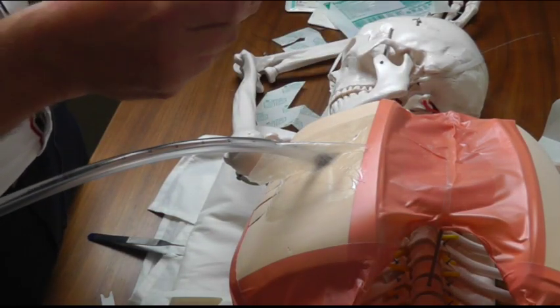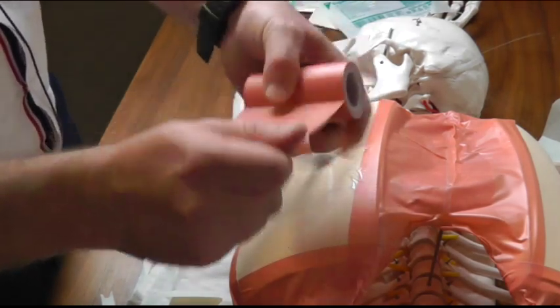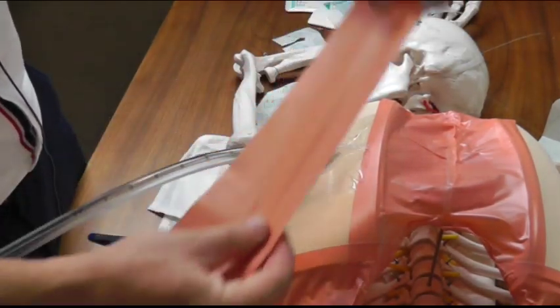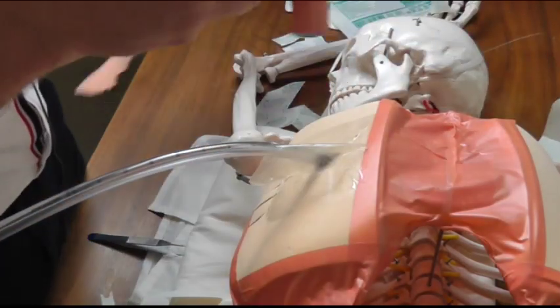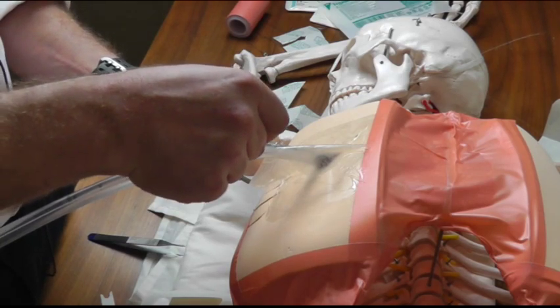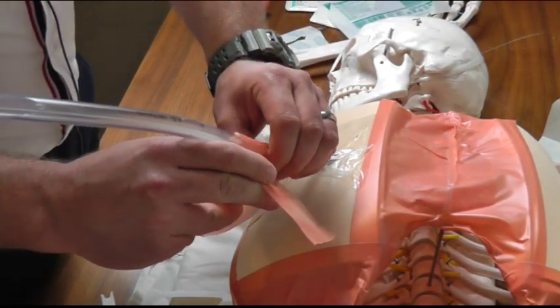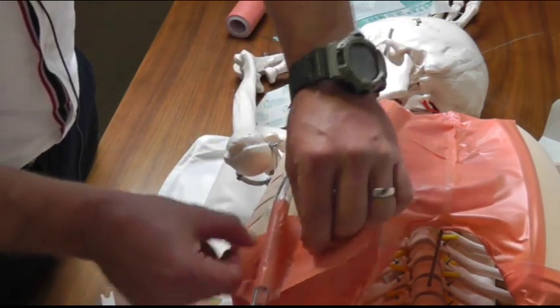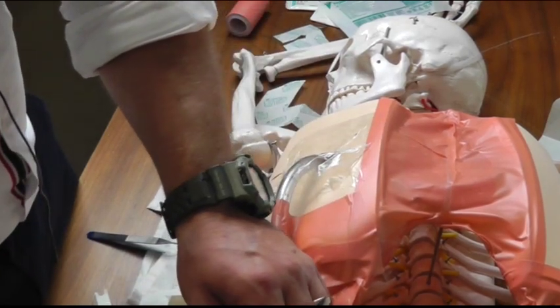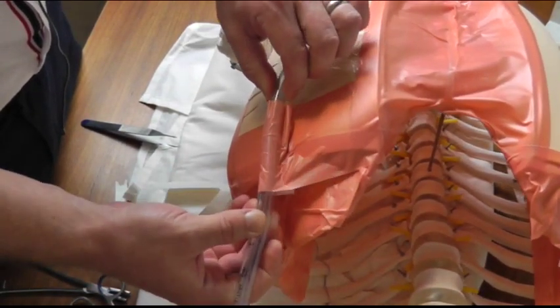You can see our skeleton model here is covered in sleek. This is a seven and a half centimeter roll. It's quite sticky tape. You can use one of these or sometimes two will actually fit on a large patient and you want to build it like a little mesentery or a little bridge with your sleek. You're going to attach that to the patient's skin on the side of their chest. So you grab a piece that's maybe 20 centimeters long, rip it off. Don't stick it to your dressing because you want that separate but just a little bit down an inch or two down from that. You wrap your sleek around the tube and join it up underneath. So it's raised on a little bridge and then you stick that down onto the patient's chest. It's just a bit of extra security so if anything pulls, as you can see, if anything pulls on the tube it doesn't want to move at all.